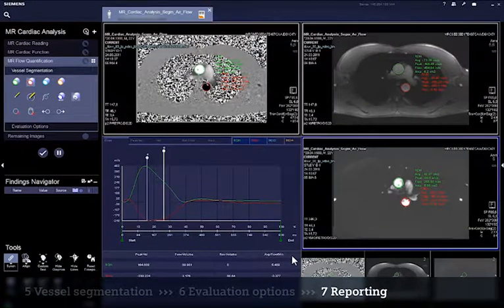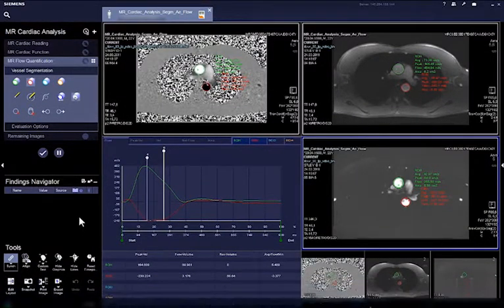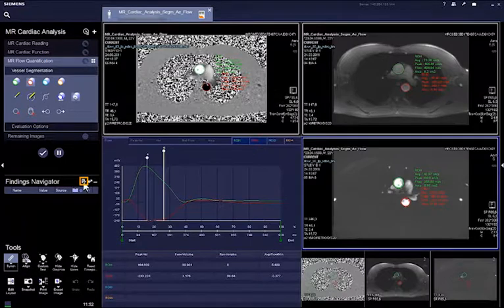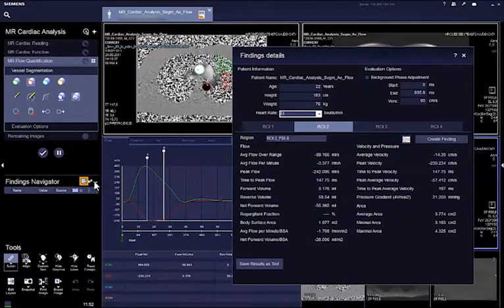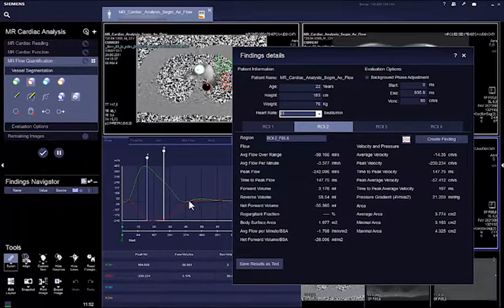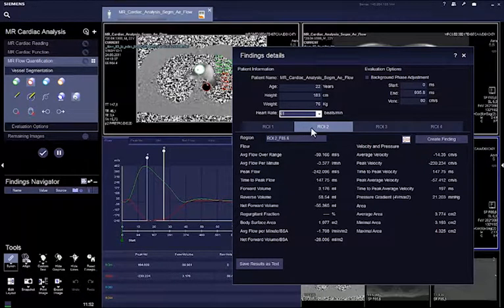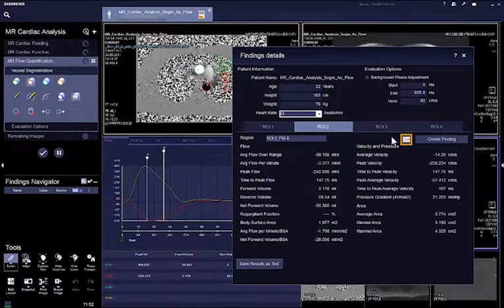Click on the findings details for more comprehensive results. If you would like to invert the polarity of the flow encoding direction for a specific ROI, and additionally adapt the results and curve appropriately, click on mirror curve.